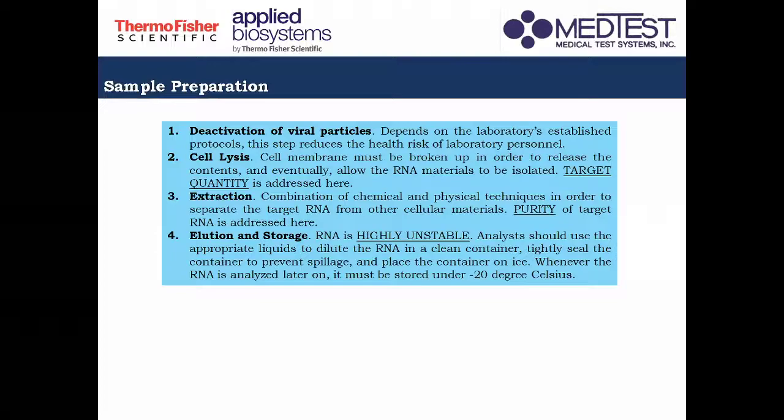Now, cell lysis is a very important step in the sample preparation because it will determine if your protocol is effective. Kasi pag hindi na-lyse o pag hindi na-disrupt yung lahat ng na-collect mong cells from your patient, there is a possibility na konti lang din yung makukuha mong target material or RNA. So in this step, or in this concept, the target quantity is being addressed here.